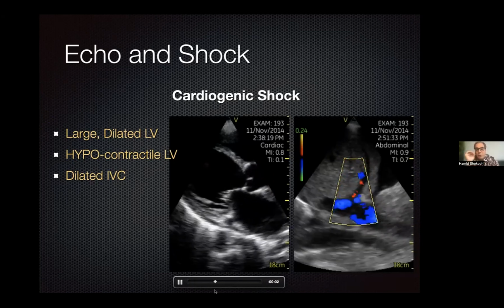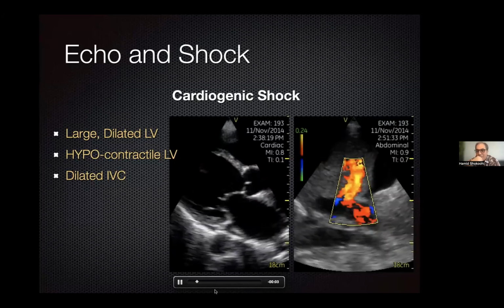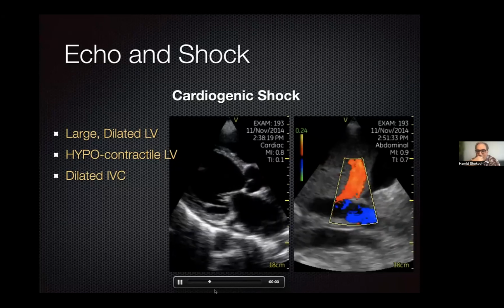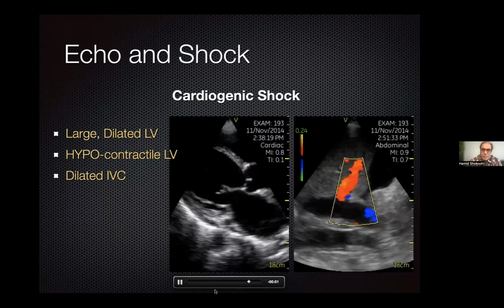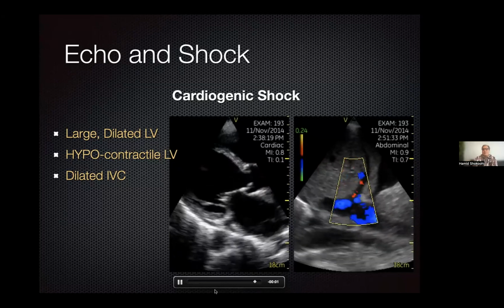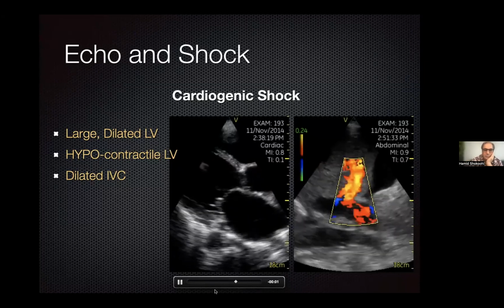And if you look closely in this one, in the liver and the IVC, you have a retrograde flow. You are expecting the flow from the hepatic vein to drain into the IVC, but as you see here, it's completely reversed. This is the reason that when you are doing a physical exam, if you remember, when you push on the liver, you have the hepatojugular reflex, basically.